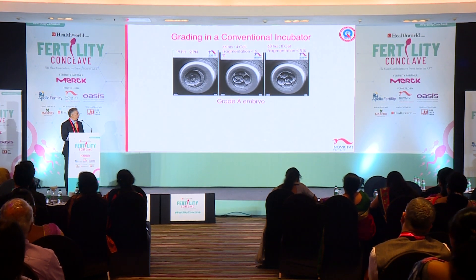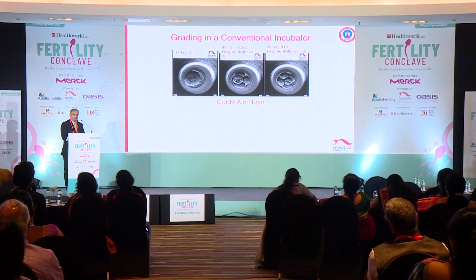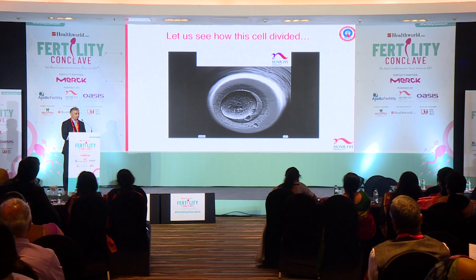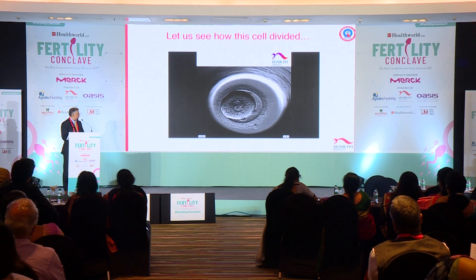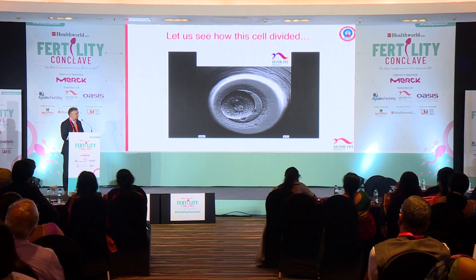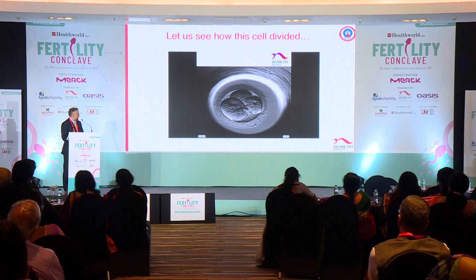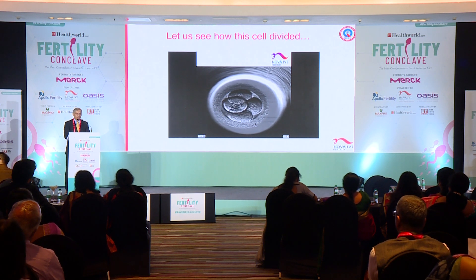These are the images of a particular embryo. The first is at 19 hours showing a normal fertilised egg. The second is at 44 hours showing a 4-cell embryo with less than 5% fragmentation. The third is at 68 hours showing a good 8-cell embryo, which under conventional grading would have been classified as a grade A embryo fit for transfer. But under time-lapse, we can see this cell divides from one cell to three cells, goes back to two cells, and then divides into four cells — an event that would have been completely missed under conventional monitoring.